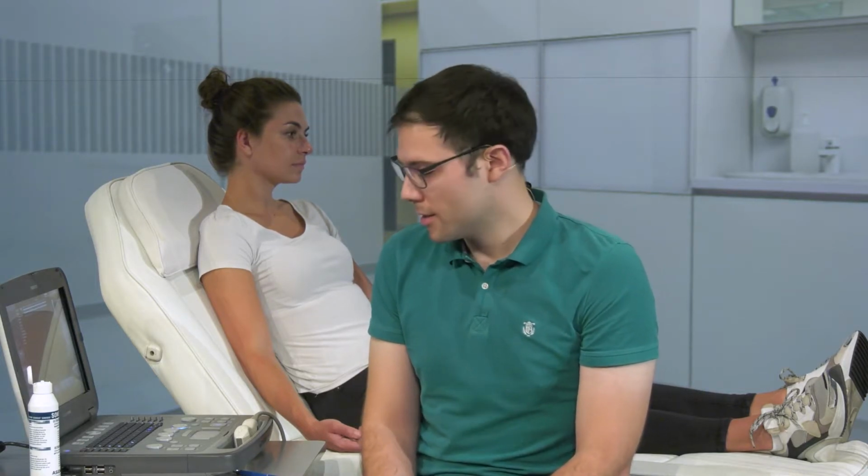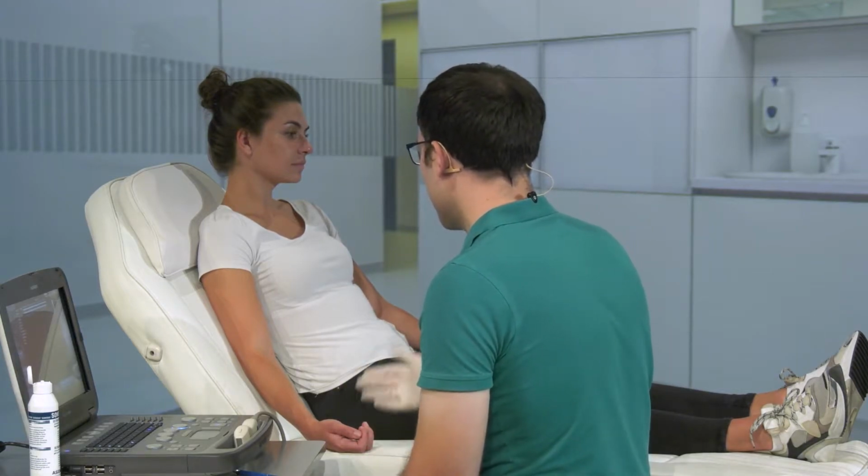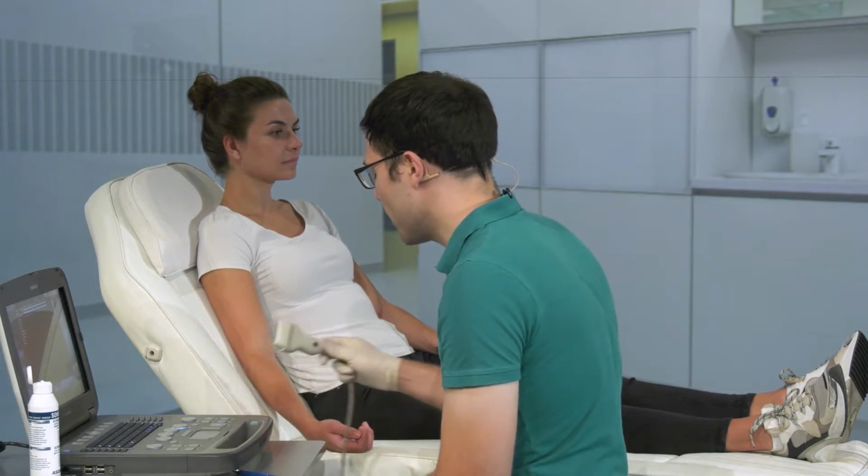Welcome to video number 4, Key Structures and Injection Sites. In the last videos, we addressed technical considerations and positioning. In this video, we will look at landmarks and their echogenic appearance. For this, we will look at the upper forearm and the salivary glands. And we'll start with the forearm.